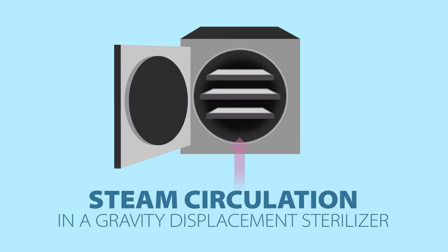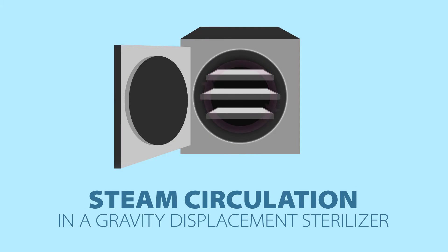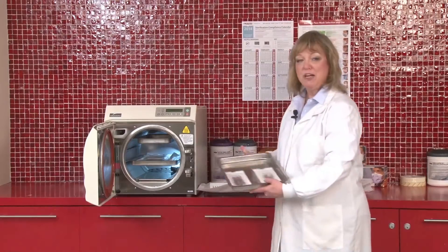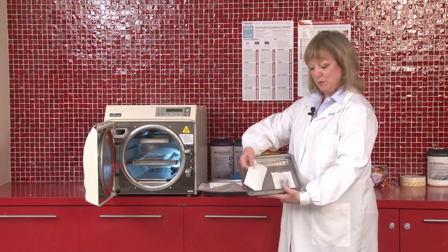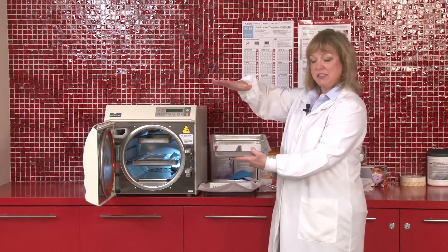Remember when we talked about how the steam enters into a gravity displacement sterilizer. It enters in from the top and the sides. Therefore, if you're using a paper and plastic pouch, we would not be loading it plastic side up. We would be loading the pouches paper side up because this allows the steam to enter in from the top.